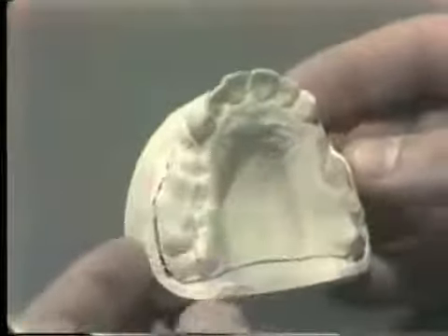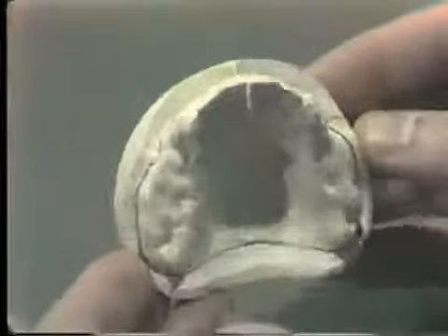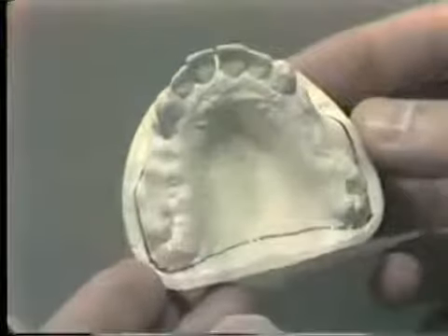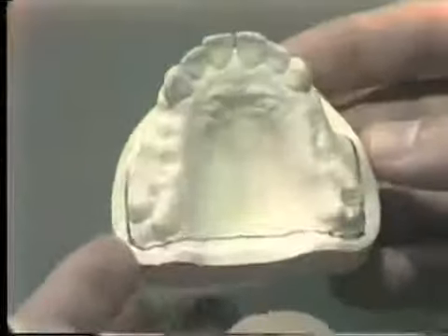After the preliminary models and impressions have been made, the first step, as with any impression tray, is to draw in pencil on the preliminary cast the outline of where you believe the finished denture will be.